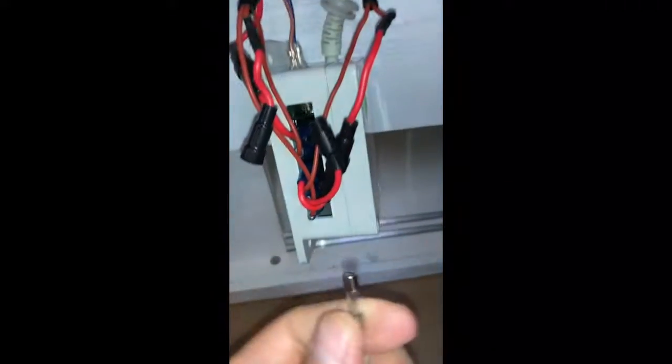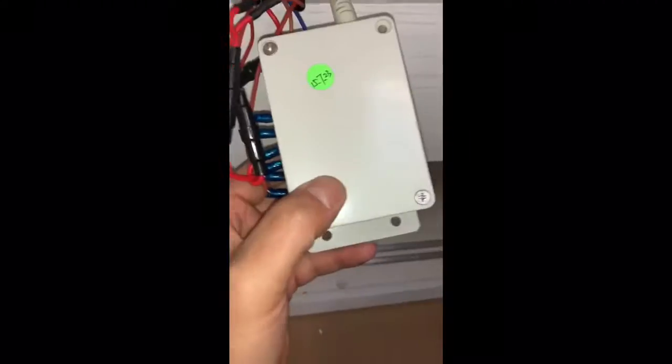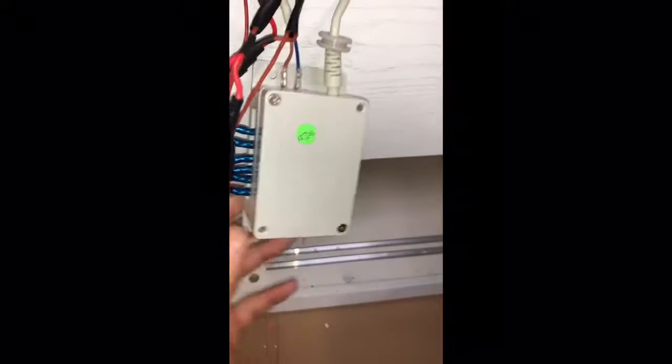If you see any discoloration on the fuse or any burnt marks, that means the problem is from the fuse. So the fuse needs to be replaced. And once that is checked, we're gonna go ahead and close it right back in there. And then we're gonna go ahead and put it in its box.